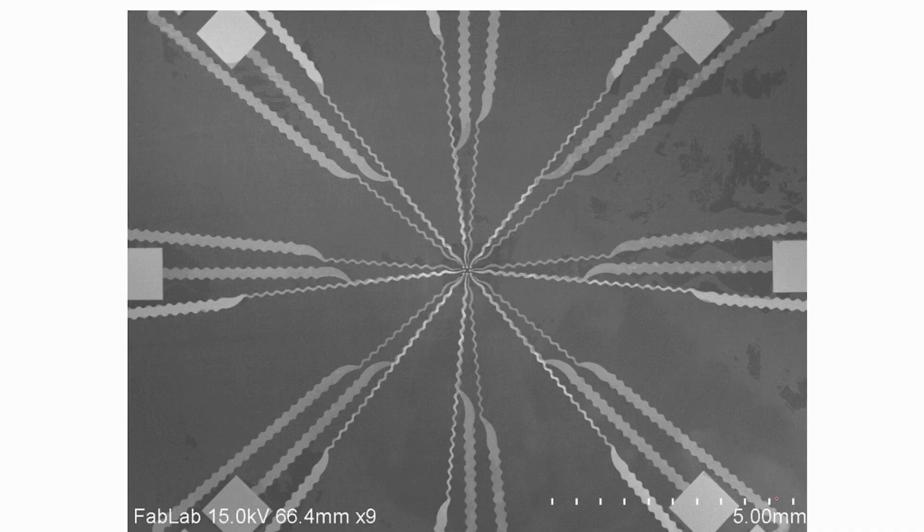So, total chip dimension is close to 10 millimeter, right, almost double of this, a little bit more than that. So, I think it is close to 15 millimeter, the overall chip is 15 millimeter, but you see where are the sensors? Sensors are right over here.